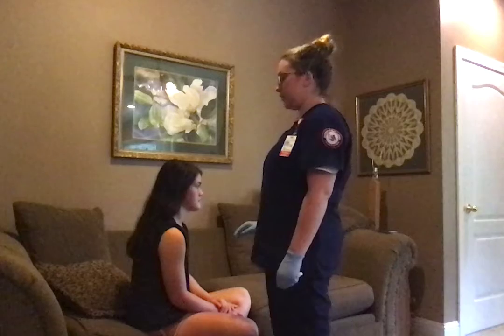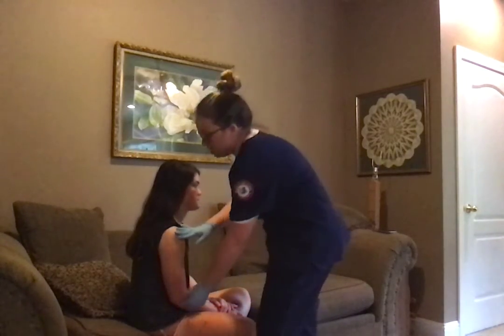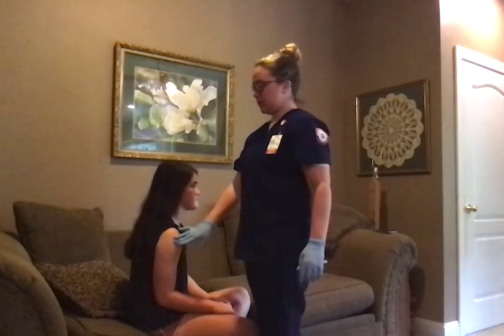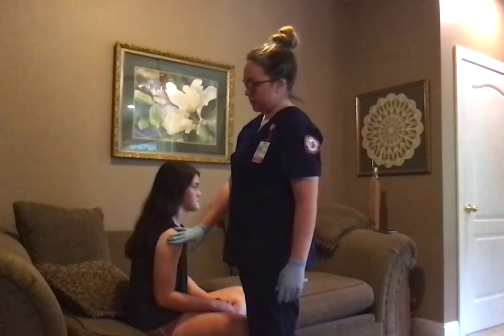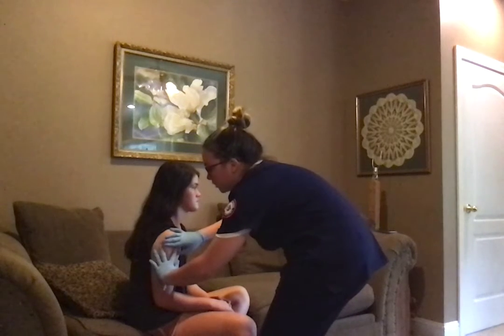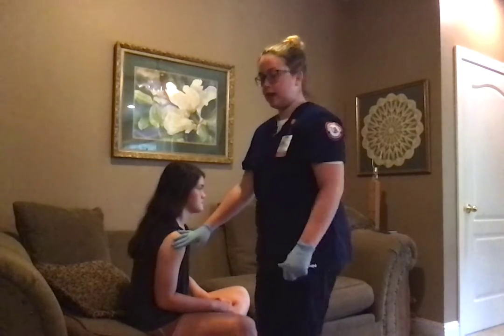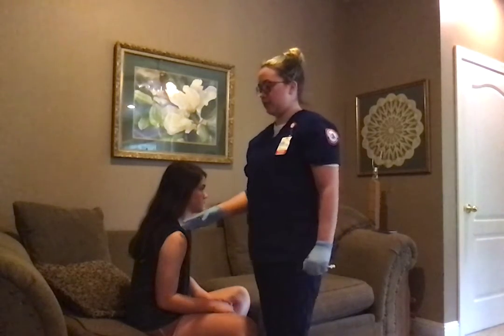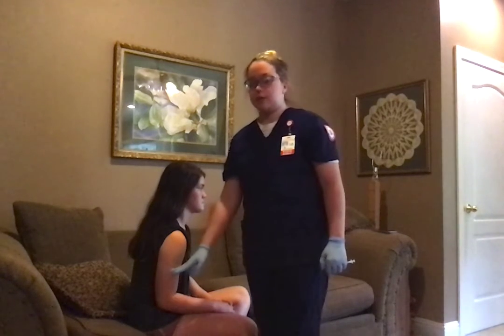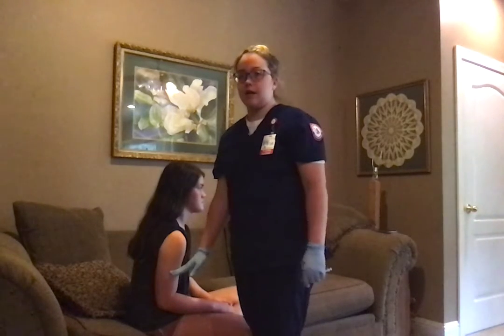So the first thing I'm going to do is to locate my acromion process over the shoulder. I'm going to move my patient's arm up and down to feel it moving below my fingers, and then I'm going to go 3 finger breadths below the acromion process, and then this triangle that is located below my finger is what we are going to use as the injection site. For these injections, we are always careful not to go above the shoulder area or below the deltoid insertion, which is where the deltoid muscle attaches to the humerus, or midway down the upper arm.